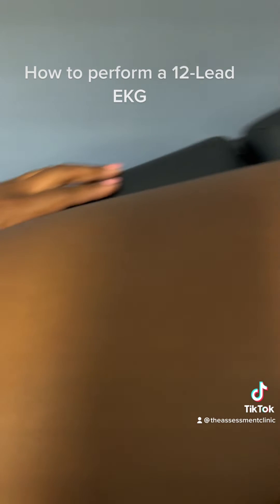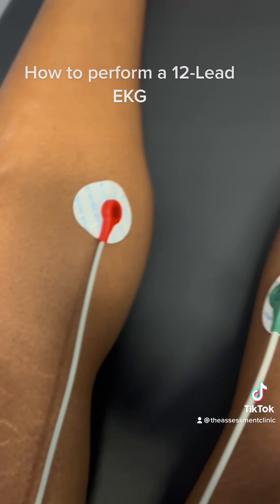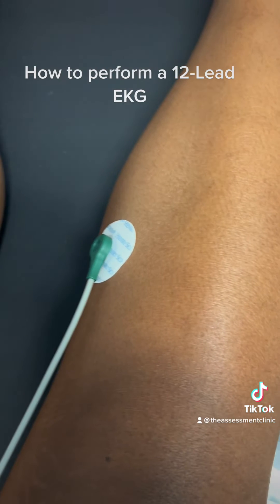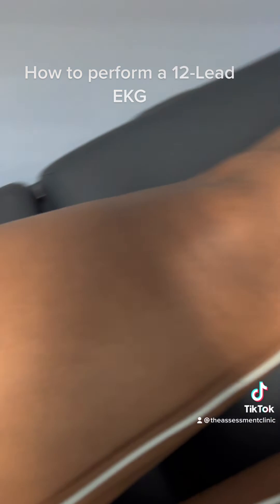When placing the leads on the arms and the legs, be sure not to place them over any bony areas. The leg leads should be above the ankle. The arm leads should be between the shoulder and elbow.